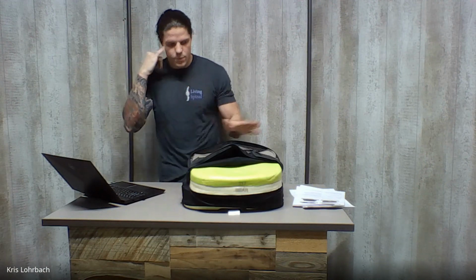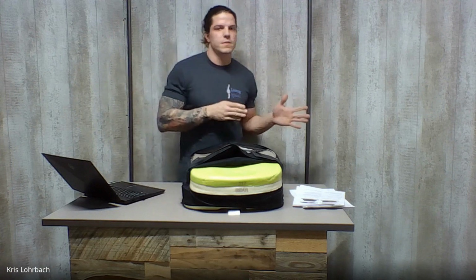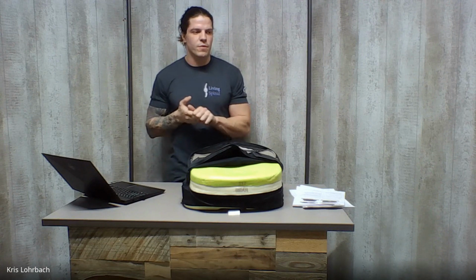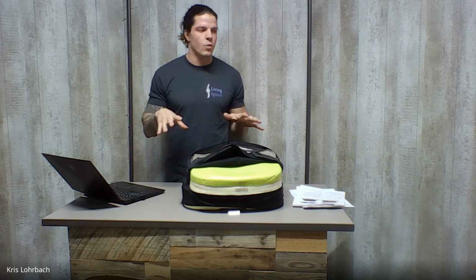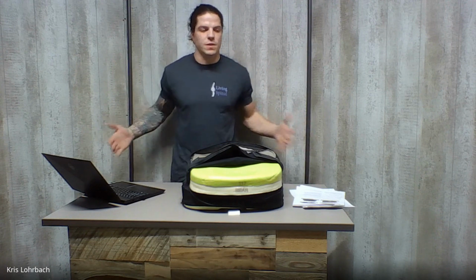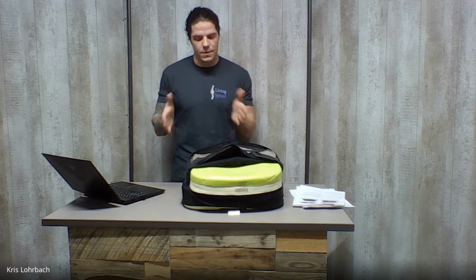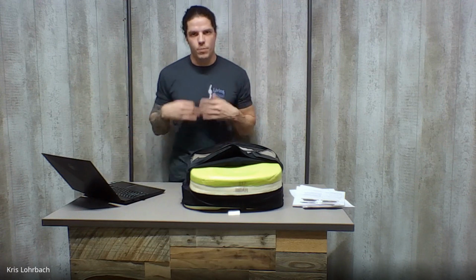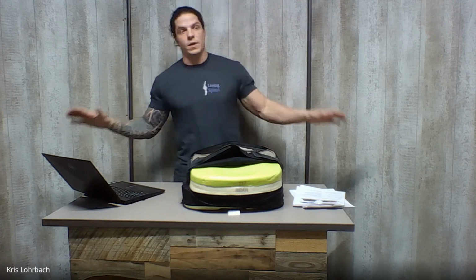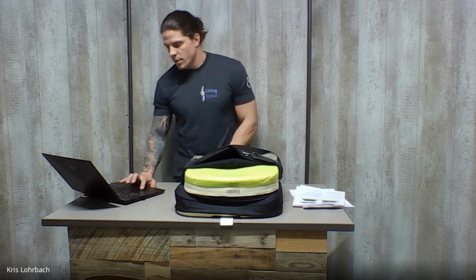As we talked about, downsides, what Andrew mentioned, also expense, and also they're just really not great for people who have really, really low abdominal stability. So people who have to use a lot of lateral supports, or people who don't use lateral supports, but they just rely on a contoured cushion to keep them upright. You put them in a Roho cushion, they've never used them before, they can feel really tippy in them, even the multi-compartment ones.